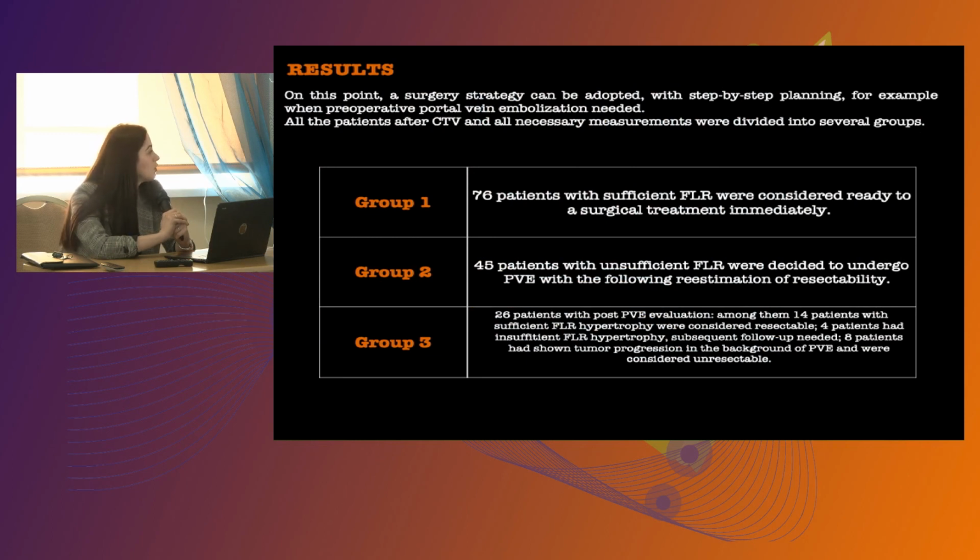Among them, we had 14 patients with sufficient future liver remnant hypertrophy, and they were considered resectable. 4 patients had insufficient hypertrophy, so subsequent follow-up needed. And unfortunately, 8 patients had shown tumor progression in the background of portal vein embolization, and they were considered unresectable.